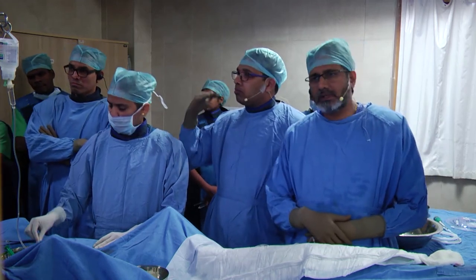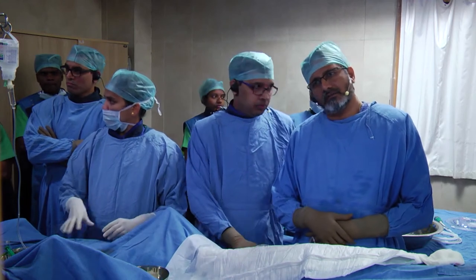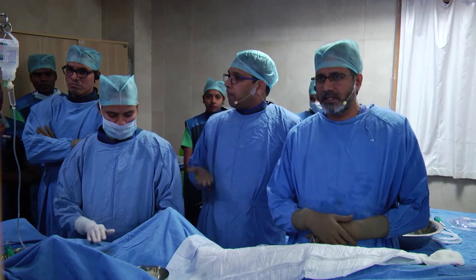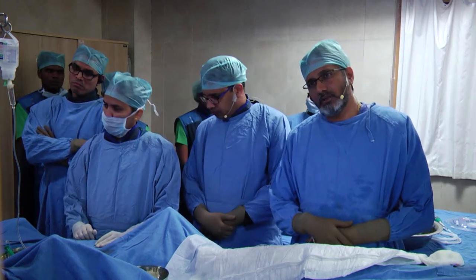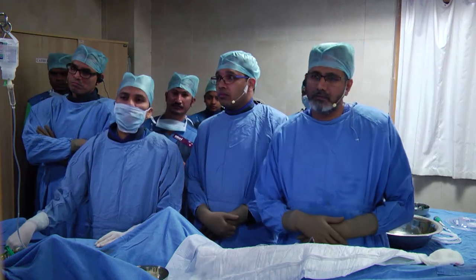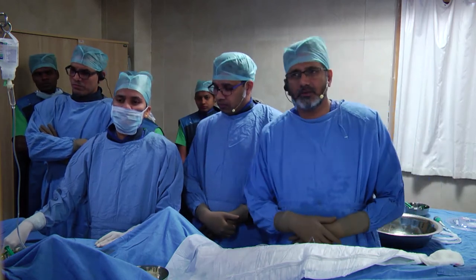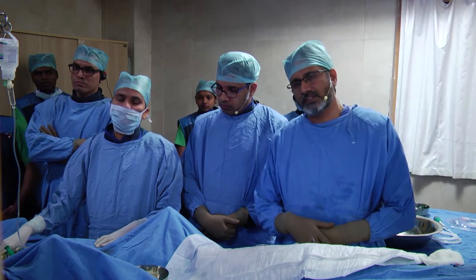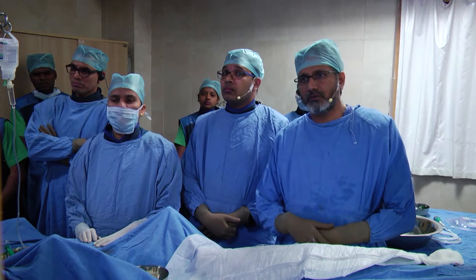the patient preferred to go for a PCI, triple vessel PCI. Doing the PCI to the RCA as well as LCX was straightforward. But the PCI to the LAD, we would like to show the OCT film. What we have done is a staged procedure. We have done the stenting to the RCA with one single stent of 48 millimeters covering the mid to distal RCA. And we also finished the stenting of the circumflex more than 48 hours before.